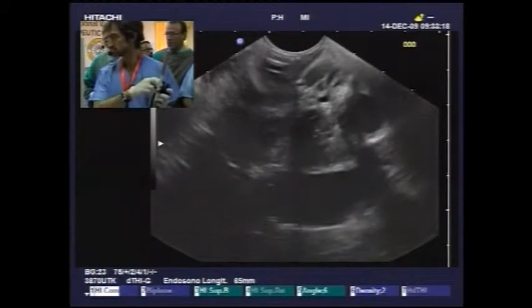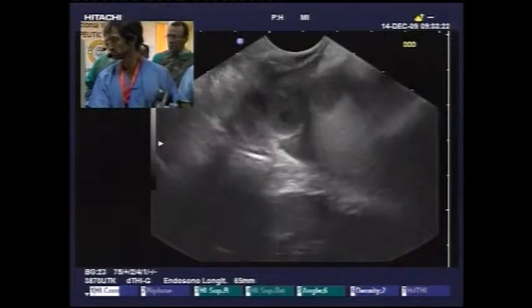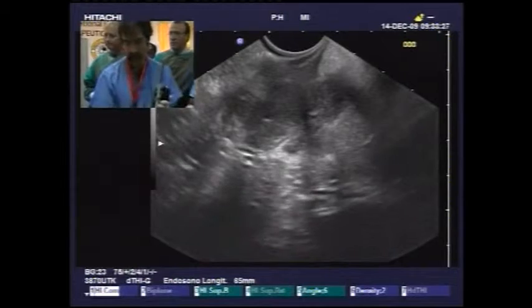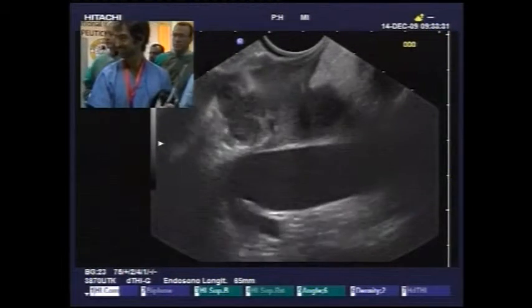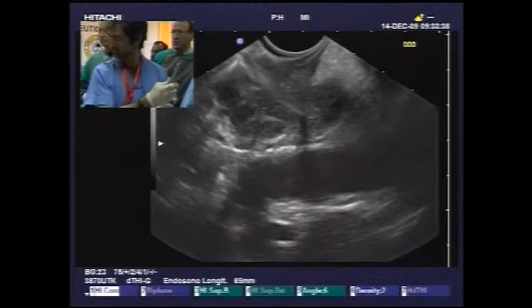And I think if we can drain this cyst through whatever means, transpapillary or transmural, then this patient will have very good symptomatic relief. And that's the philosophy that we're thinking. Because if you look at the ERCP picture here, it's a very large cyst which is very freely communicating with a dilated duct, markedly dilated duct. And there's a lot of pus in the fluid.